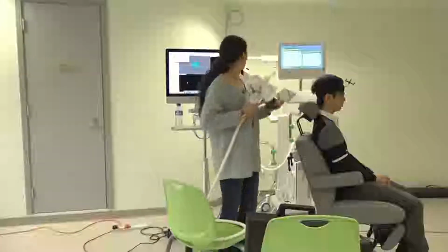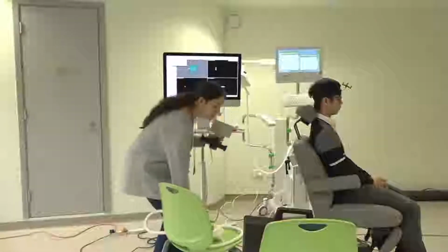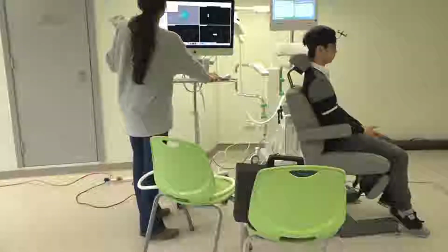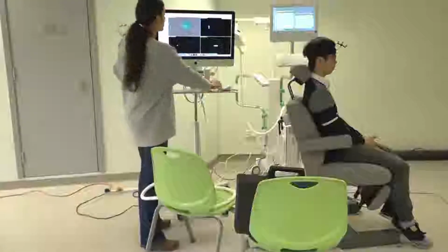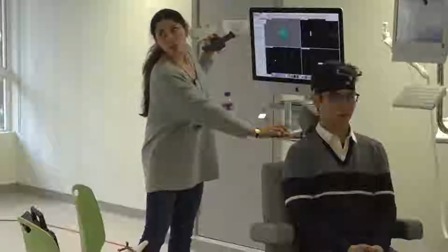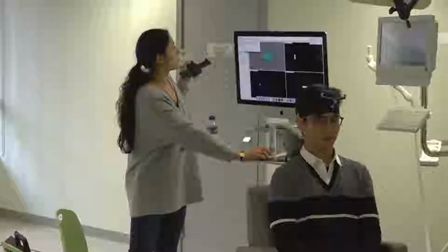To do this, you go to, pay attention to this, the app window, TMS coil calibrations. As you have already created this, for the cool coil you can create a new one. So you click the one that we already have, and you do recalibrate. If it's a new calibration, you click new calibration. So recalibrate, and then you have a window.